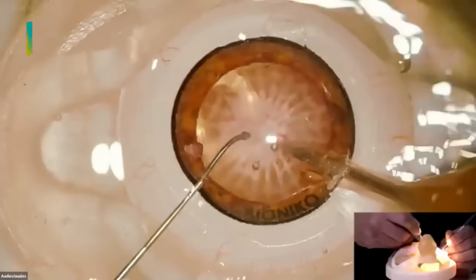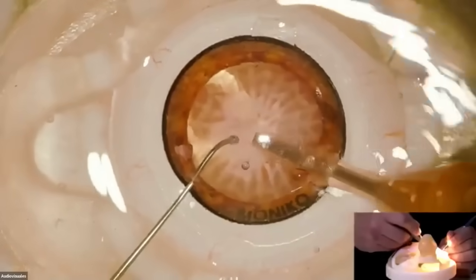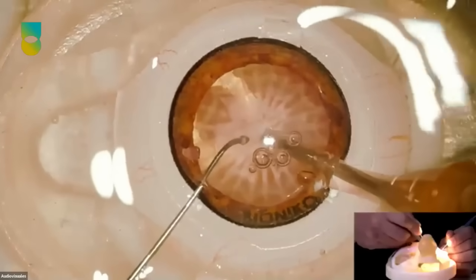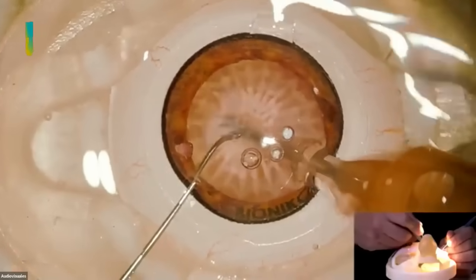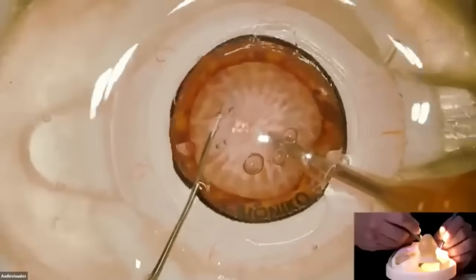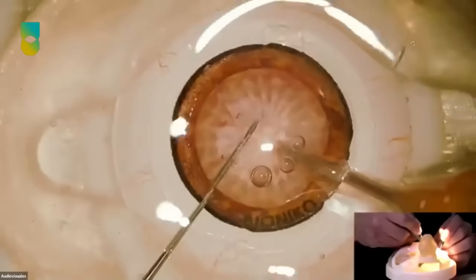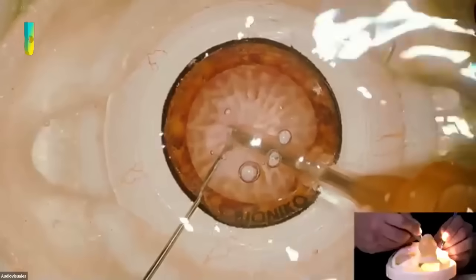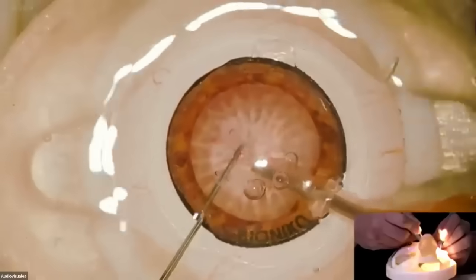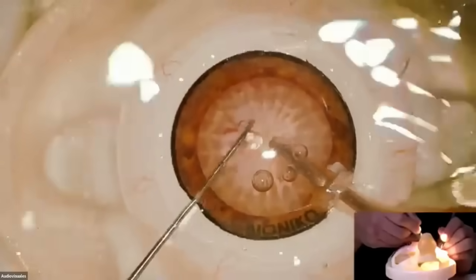There are so many things to learn here, right? Especially we can see what David was saying in the beginning about how you can lose so much fluid from the main incision while you're moving. You need to move very, very still in that incision, and you need to float to the incision in this time too, to protect it and not to burn it. But he's doing a very good job, but there are so many things, because this is the key here, guys. There are so many things happening. His foot pedal, 2 hands, you know, 2 feet working, watching in 3D, and making decisions. So this is Phaco surgery. And he's doing a good job, but he's integrating.